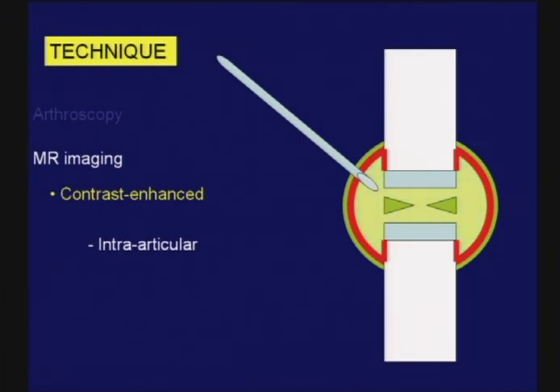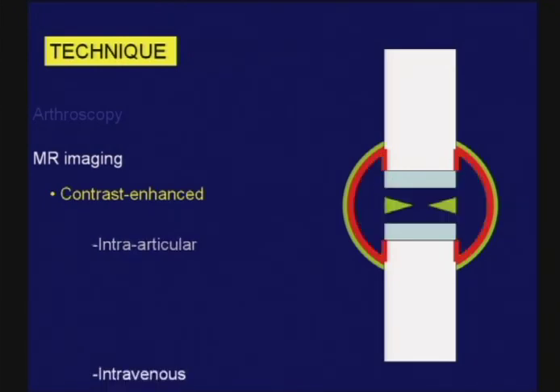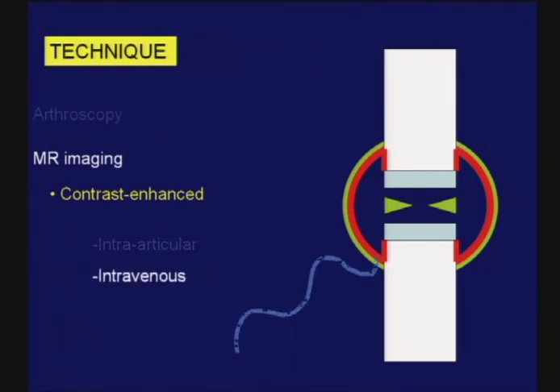In MR imaging, we have many choices, one of which is whether to use contrast agent. We can deliver that contrast agent in two ways. An intra-articular injection, so-called direct MR arthrography. As I mentioned to you yesterday, we use this technique in a limited fashion, but mainly for glenohumeral joint instability and the assessment of the labrum of the hip. And during this course, we will address in great detail the role of MR and MR arthrography with those particular problems. The second way we deliver the contrast agent is by the intravenous route.